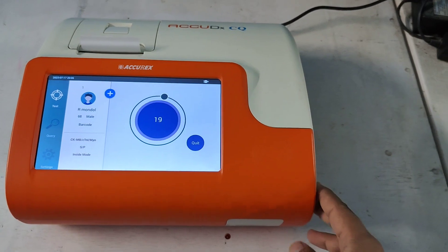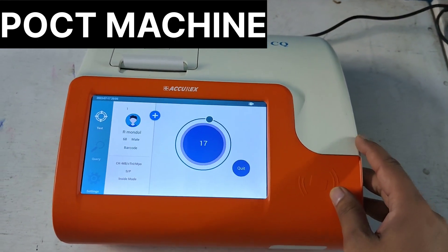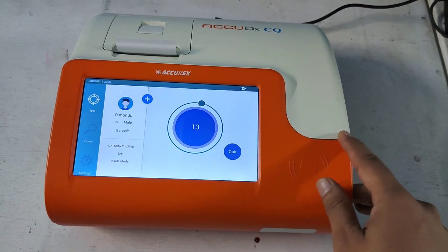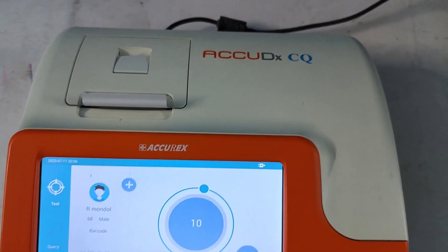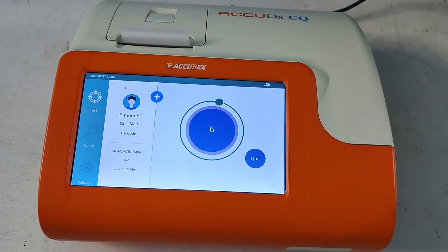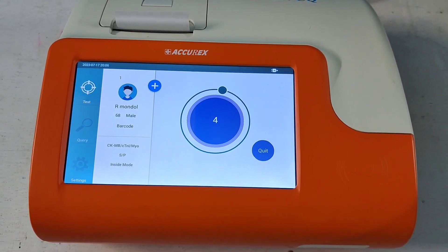The market value of this POCT machine is less than one lakh, so you can afford it. The brand is ACCUREX and the model number is ACCU Dx CQ. Now let's see — it's time to show you the result.